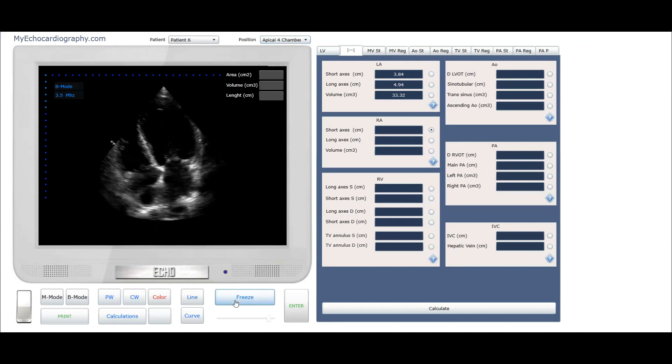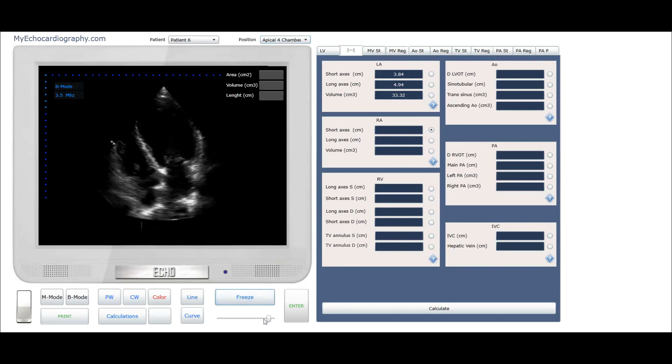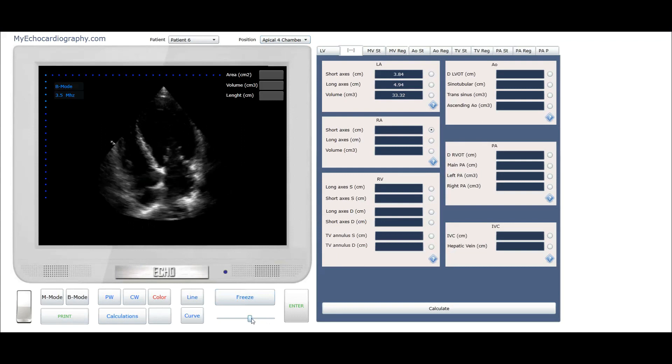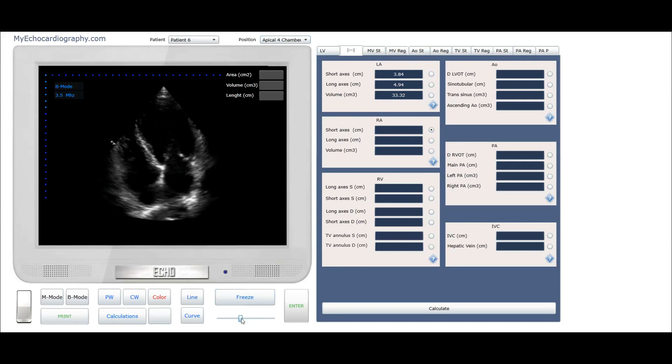This view is the best for the linear and volumetric measurements of the right atrium. Freeze image and find end systolic position of the right ventricle.